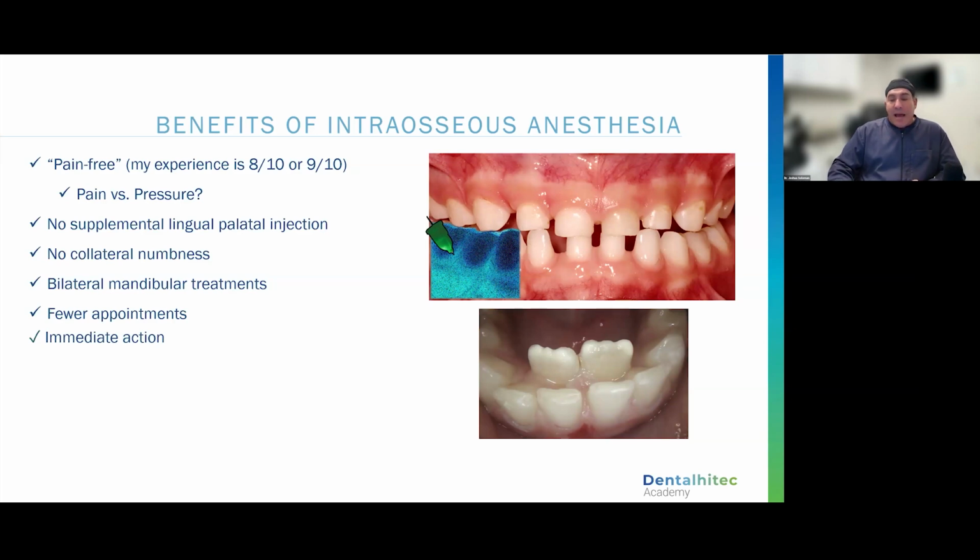When we say immediate action, it truly is immediate action. If you're truly delivering your intraosseous local anesthetic at the correct amount in the correct areas, you should be able to take that needle out and start right away. I didn't believe it at first, but after doing this for a couple of weeks and being able to start treatment immediately, it's a complete game changer. We can deliver the anesthesia and just start working right away.